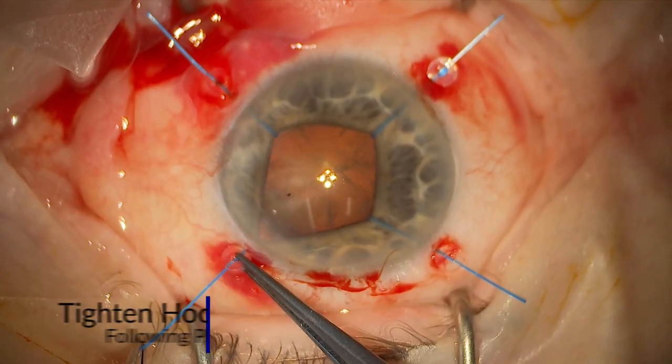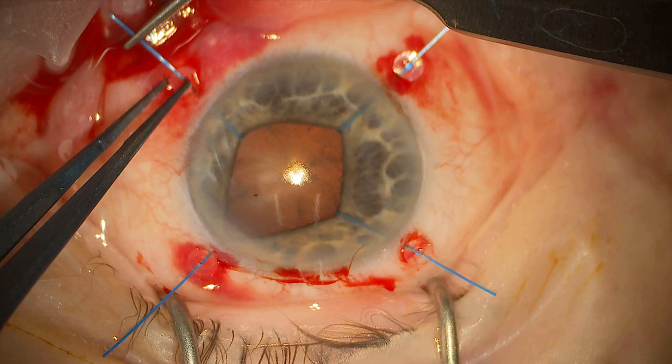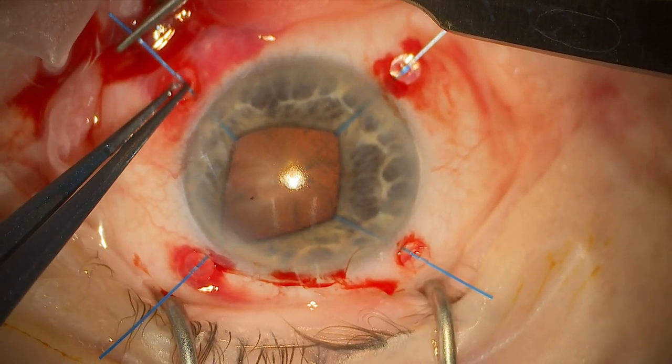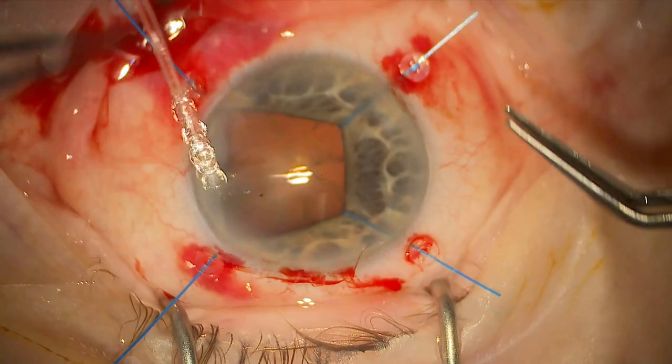Now I'm starting to tighten up the iris hooks one by one, and you can see me starting with the first. There is argument that you don't need to tighten them this much, and in hindsight you can damage the iris root when doing this, but at the same time you need to ensure that you have good access to the cataract to ensure that you have a safe surgery.